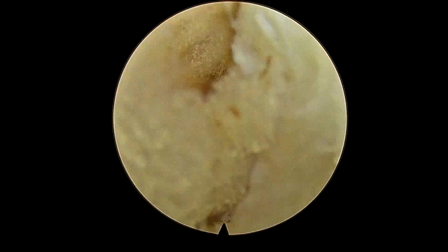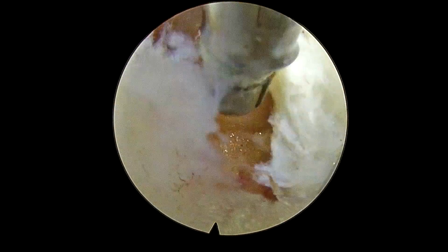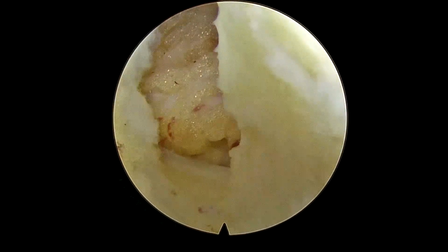So the ligamentum flavum has been removed from medial to the lateral aspects. Now we will try to visualize the lateral recess. So here we are removing the ligamentum flavum from the lateral recess. At every step, whenever you see any bleeder, try to coagulate that bleeder. One more thing here, we are not touching the fat as of now.